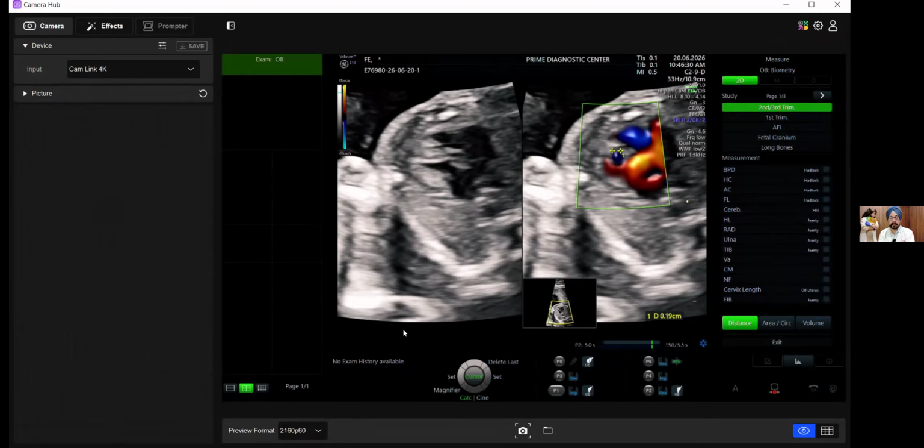The problem is that there we would have a normal pulmonary artery flow going behind the aorta, which tends to overlap it. So we may not be able to get a good result. This rule, as you rightly said, applies for muscular VSDs only.